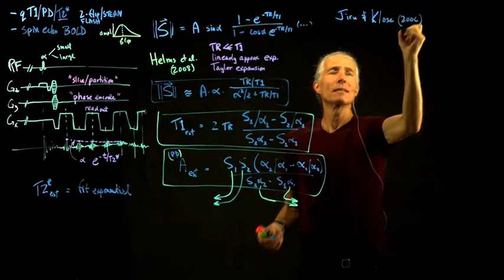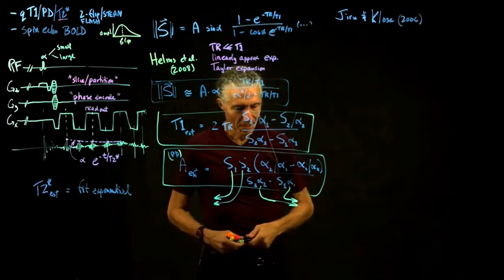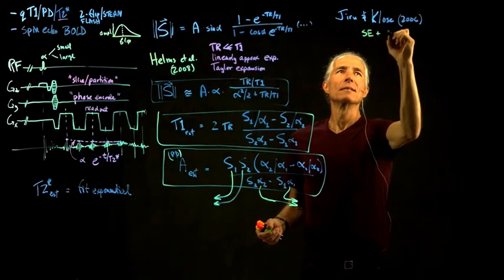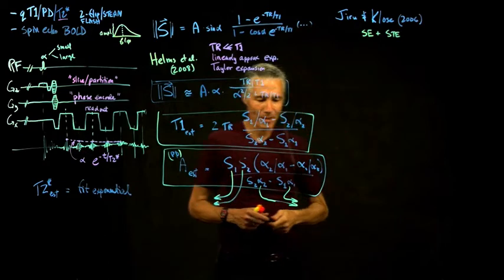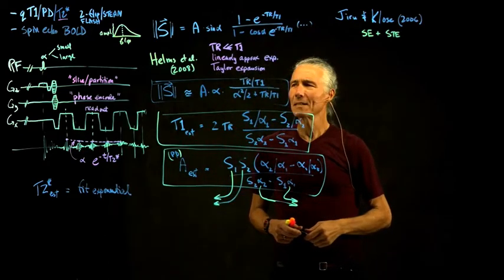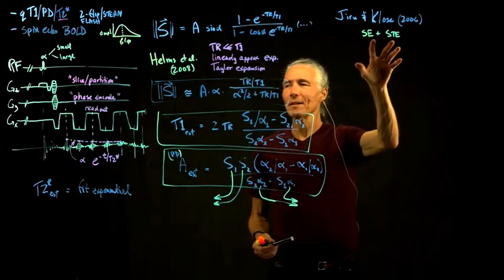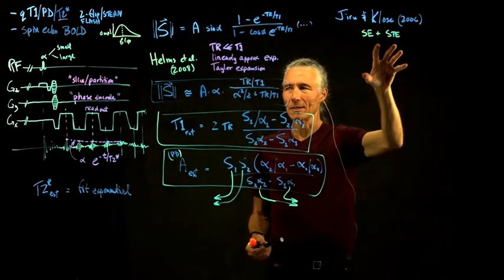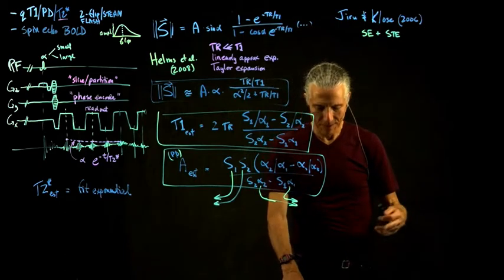What they did was collect spin echo plus stimulated echo, sometimes called STEAM. I can't remember what STEAM stands for. Stimulated echo, and I'm not sure. Sorry. But anyway, collect 2 different echoes with 2 different equations for those 2 echoes. We went over those equations before. There's a typo in the notes, but I'll fix it here.